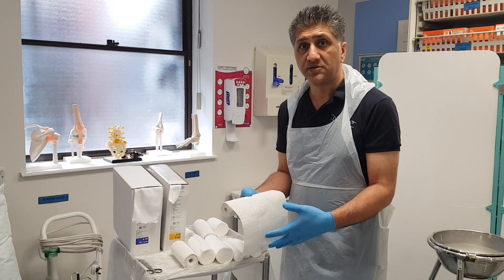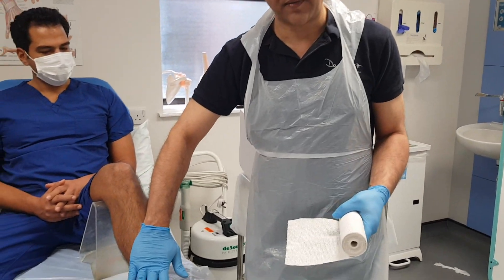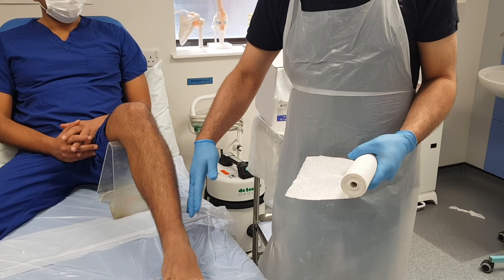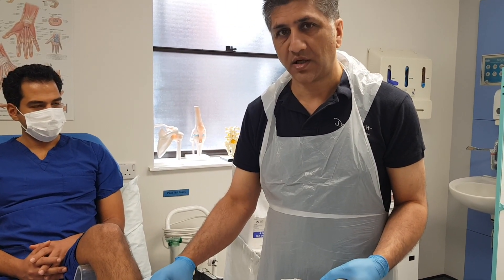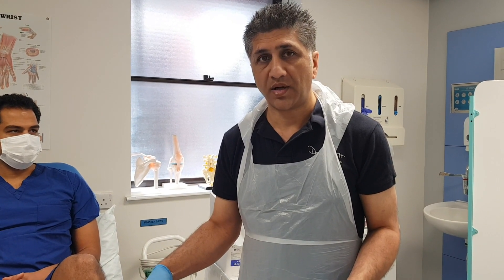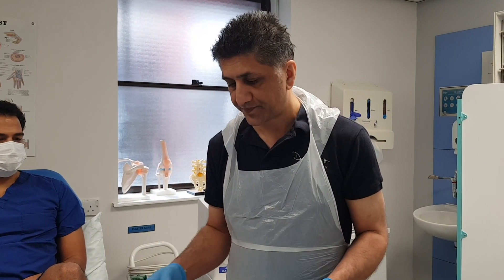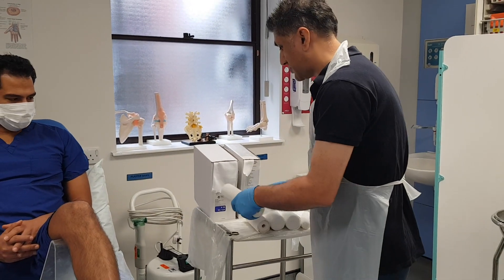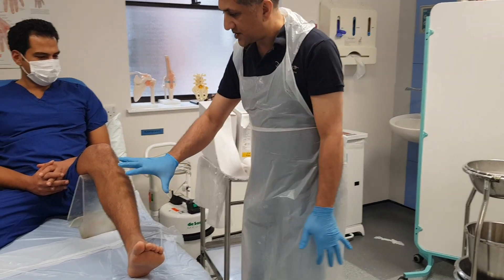I'm going to use quite a wide 20-centimeter slab because these injuries are generally twisting injuries. We don't want a slab which covers one surface — we want a slab which covers three surfaces so that it prevents any rotation. But we want to leave an area uncovered so that if there's any swelling we don't cause compartment syndrome by making it too tight.